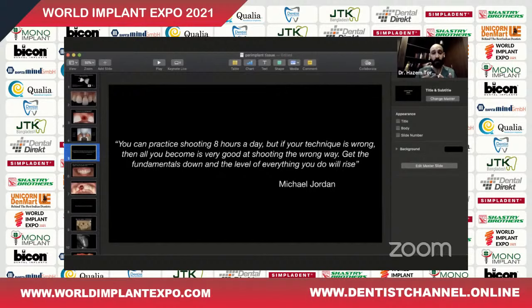If you are used to taking impressions directly on abutments, you're going to be good at taking impressions directly on abutments, but definitely your final outcome will not be precise. You will not be able to take all the information, the finish line and the exact mimicking of the abutment itself. You cannot transfer that. And therefore, for you to be able to do something the right way, you have to get the fundamentals down, and the level of everything you do will rise.